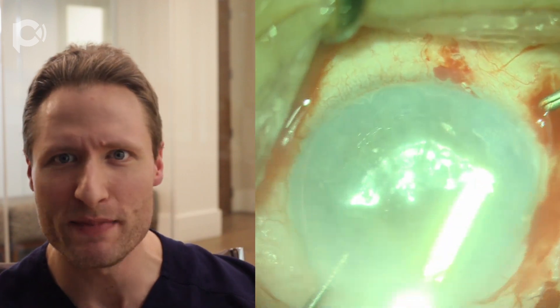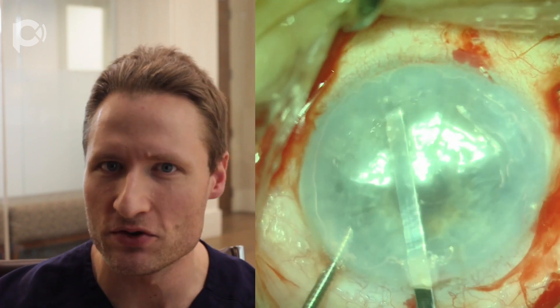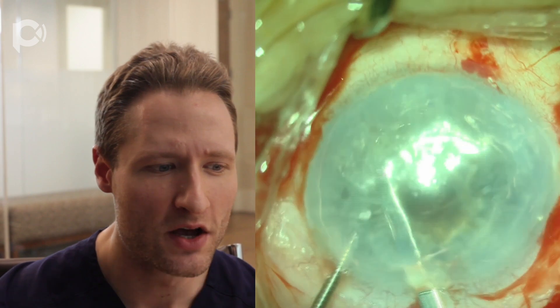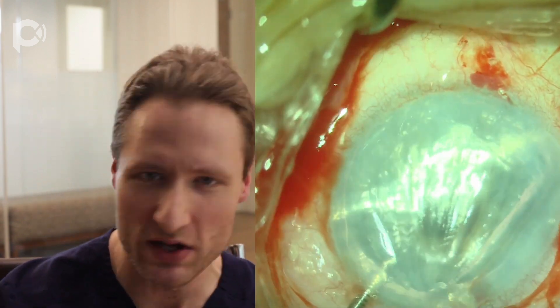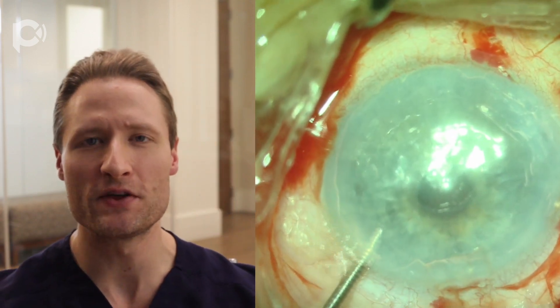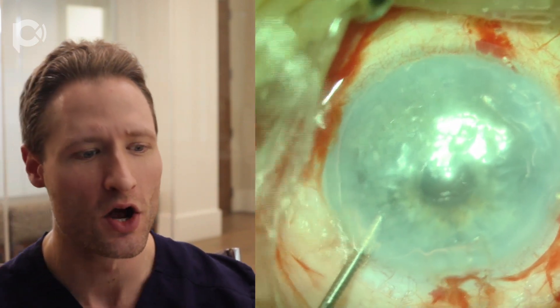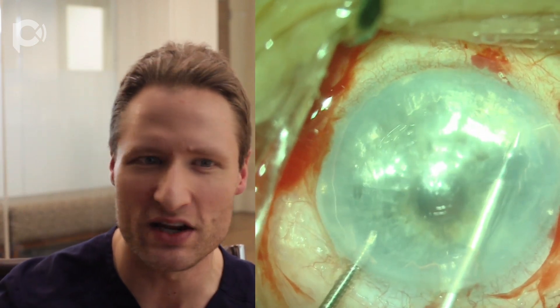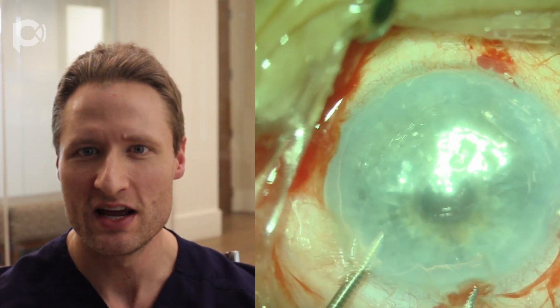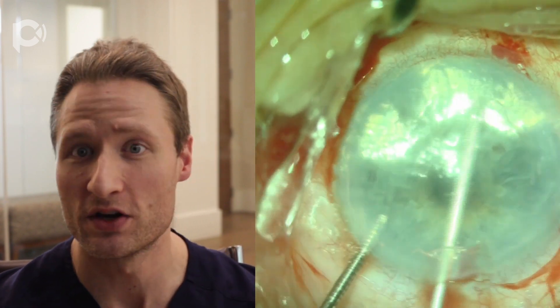I'm going to make a peripheral iridotomy in this patient, but I wait to do that until after the stripping is done. The reason is that when you're stripping the endothelium, you may have some chamber instability, and you want to try to keep the vitreous back during that period. You don't want the vitreous herniating up through an iridotomy. So I like to wait until all of the stripping has been done and the chamber is stable before making an inferior peripheral iridotomy.